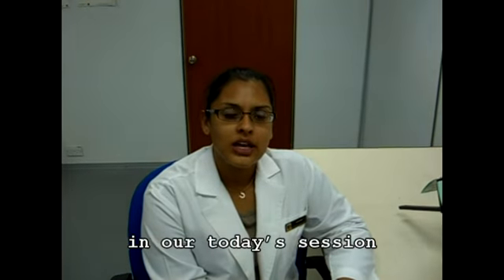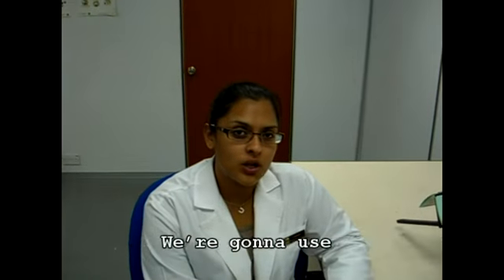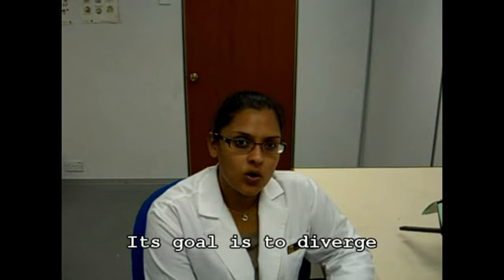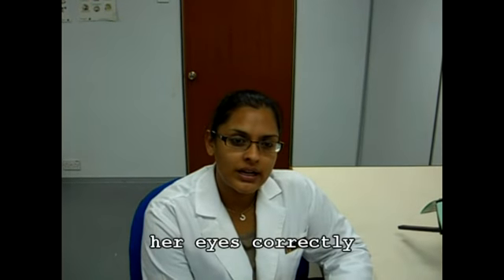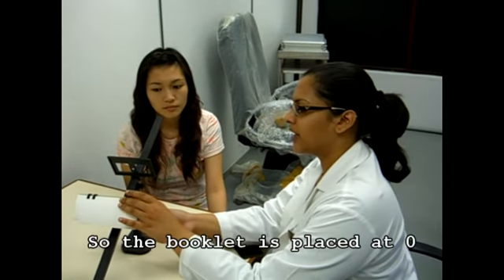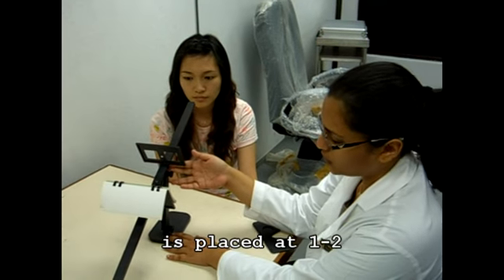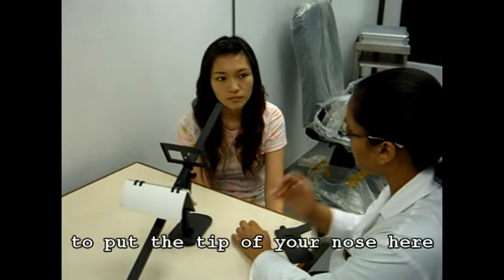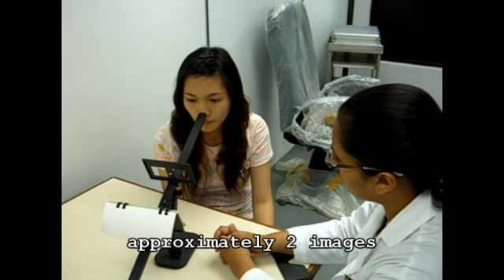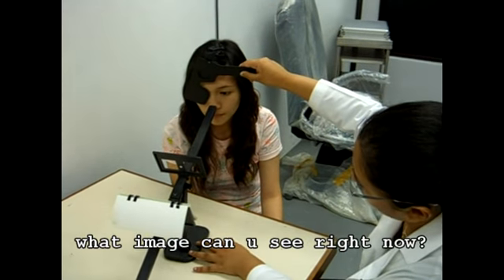Hello again. In our today's session, we're going to look at a patient with divergence insufficiency. We're going to use the double aperture to be able to train her divergence. Its goal is to diverge her eyes correctly so that sensory fusion may take place. So the booklet is placed at 0, while the double aperture is placed at 1 to 2. Now I'm going to ask you to put the tip of your nose here, and now you can see approximately 2 images. Yeah. I'm going to ask you, what image can you see right now?